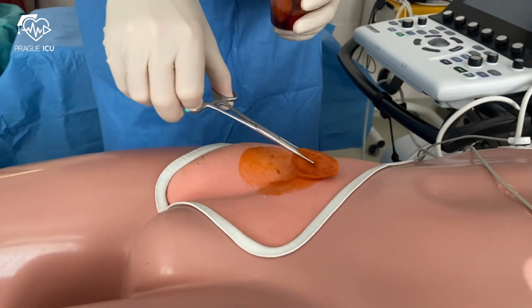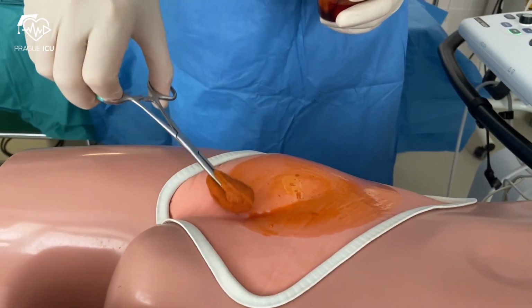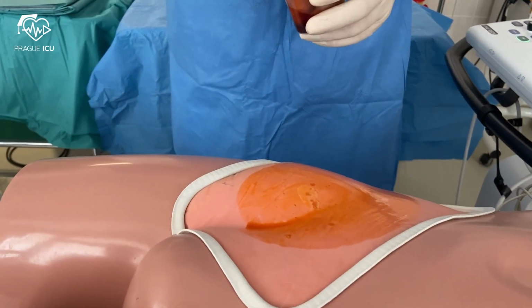First, apply the aseptic skin prep widely around the insertion site. Start from the center and move out. Never come back to the center.